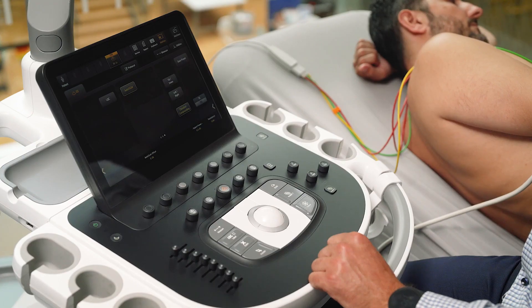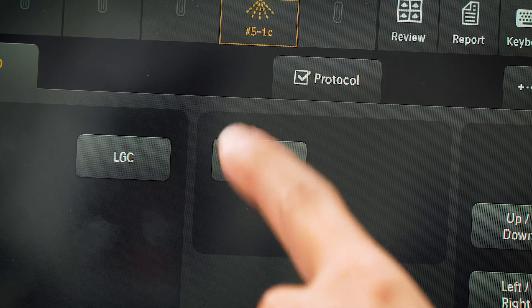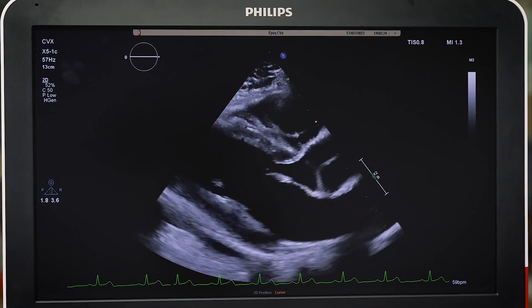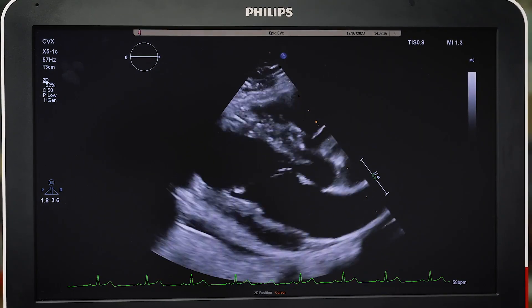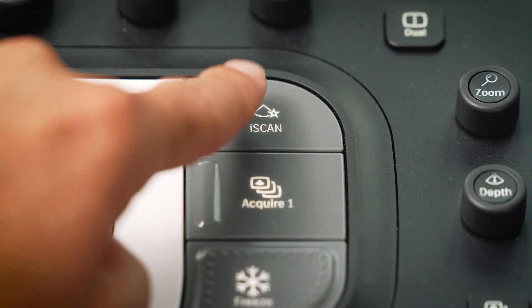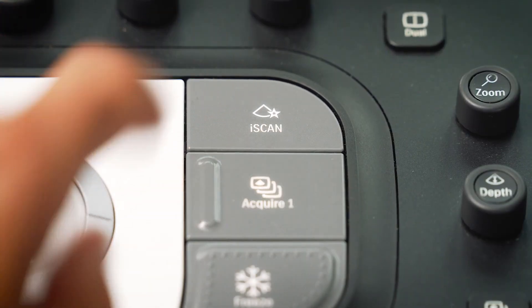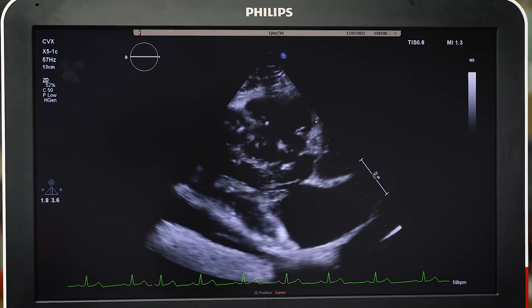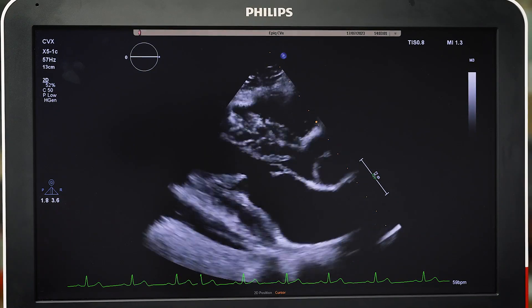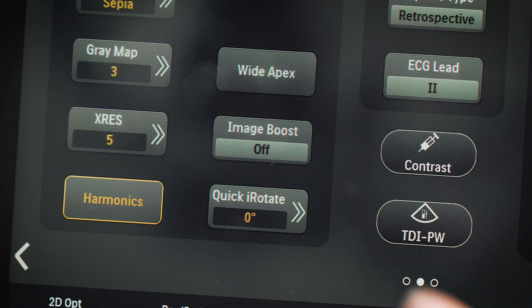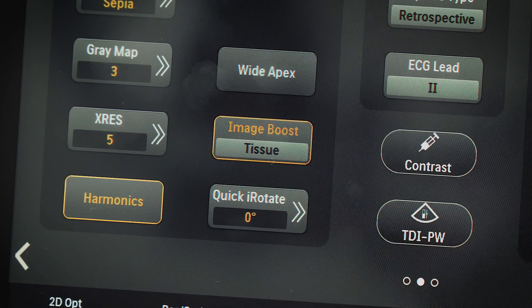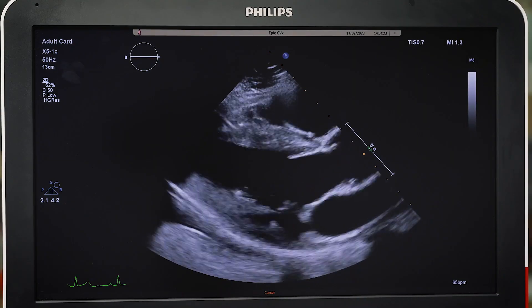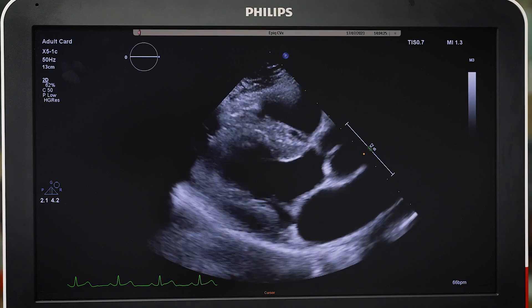Autoscan automatically and continuously optimizes the 2D image brightness at the default gain and TGC settings. iScan automatically optimizes the 2D image gain and TGC settings when selected. Image Boost works by boosting returning signals from the myocardium and other cardiac structures, while suppressing unwanted clutter.